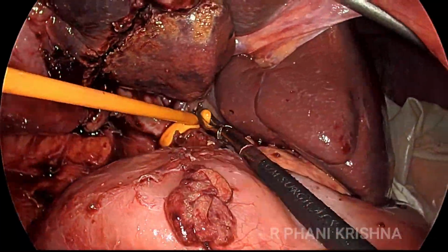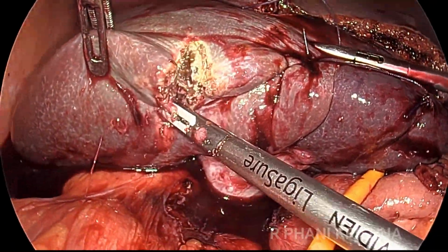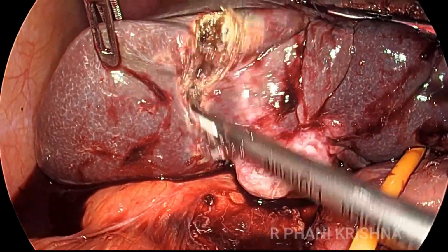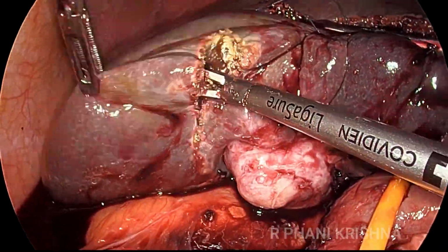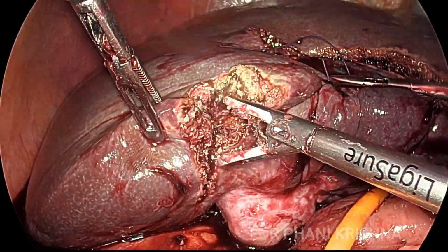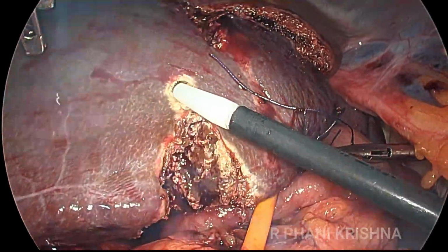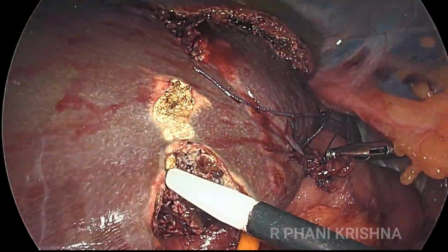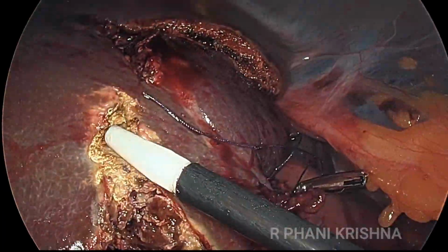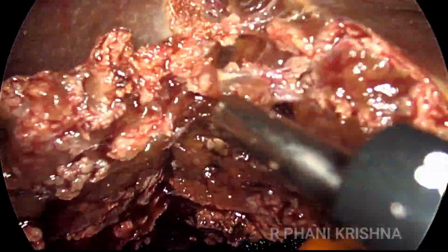Now we shift the camera to the right side. We're putting the Pringles again. And from the right side, the lateral side of the wedge, we are starting the parenchymal transection to join the medial transection line. Now these two transection lines are being joined together.